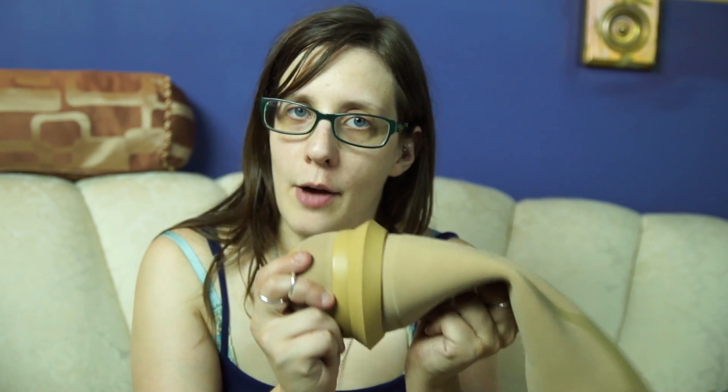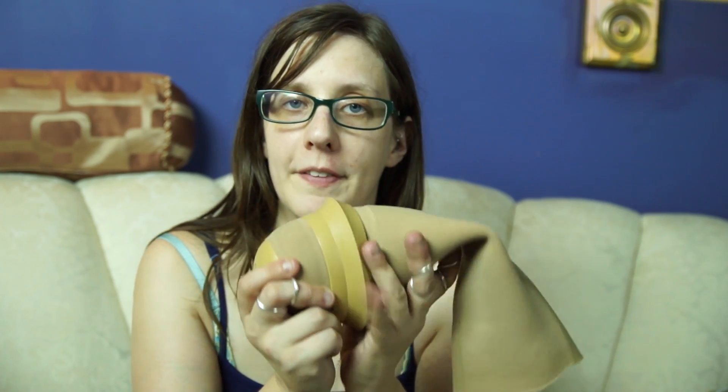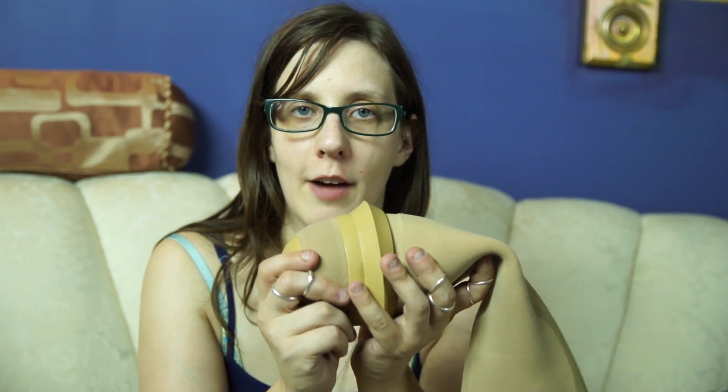So you might be wondering, how then do you get your leg out of your prosthetic if you have a suction liner with a one-way valve? Well, the answer is that usually the one-way valve has a button on the end that allows air back in if you press the button.